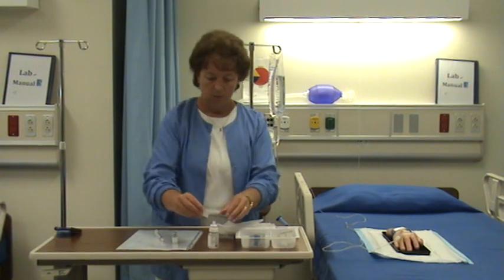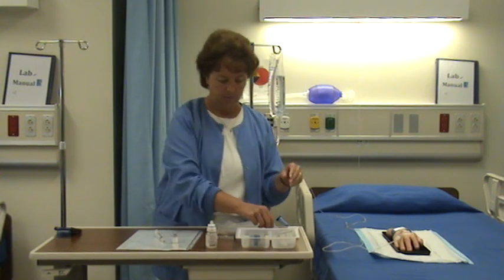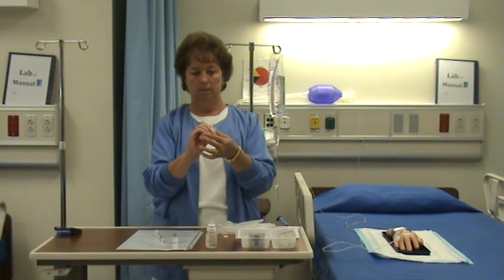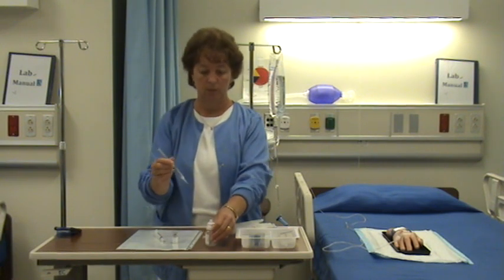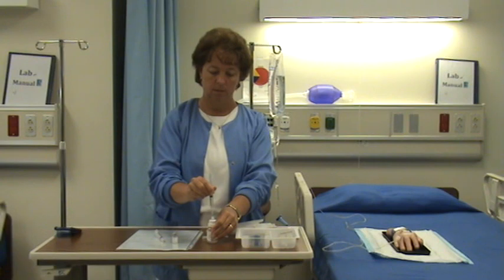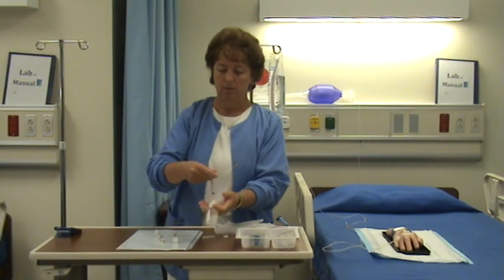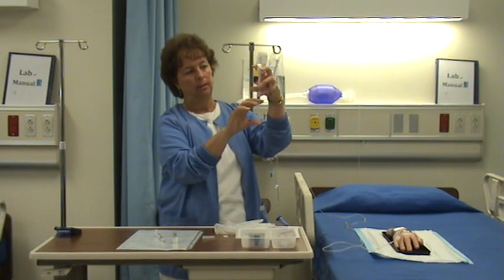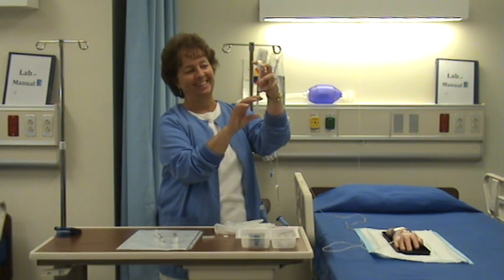So I'm going to draw up a post-flush of 2 milliliters, because that's what we use in the lab for our flushes. Usually it's, like I said before, 3 milliliters, depending on where you're doing your clinical. But we like to conserve in the lab.